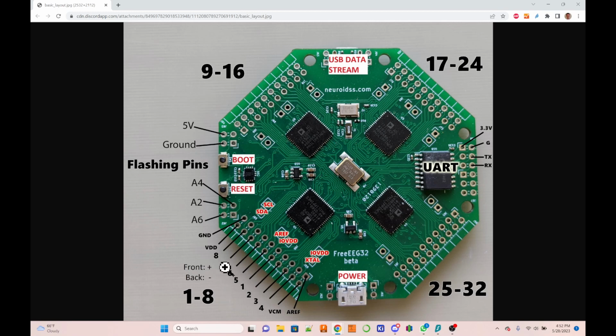Right? And so this is the first ADC with channels 1 to 8, and then here we have 9 to 16, and that means that right here this is channel 9, 10, 11, 12, and then again back to the middle, 13, 14, 15, and 16. Is that clear? Sorry. It's the one that's closer to the edge is for negative, and the one that's closer to the center of the board is positive. Yeah, that's correct.